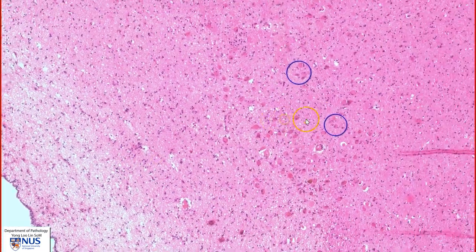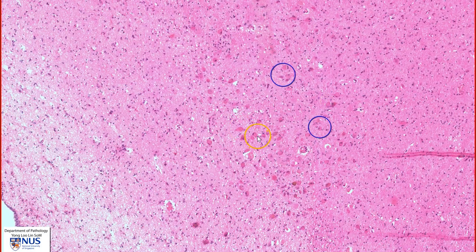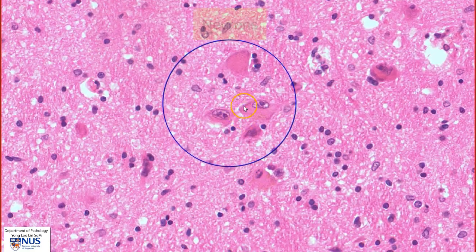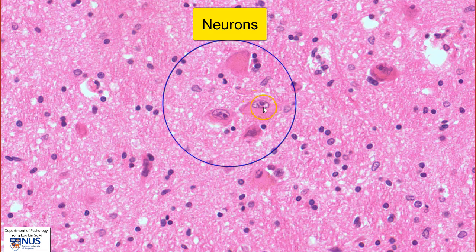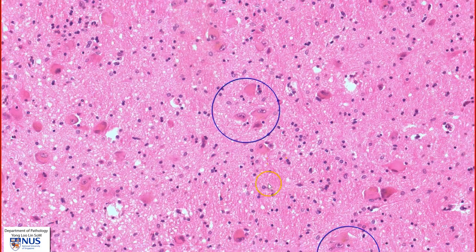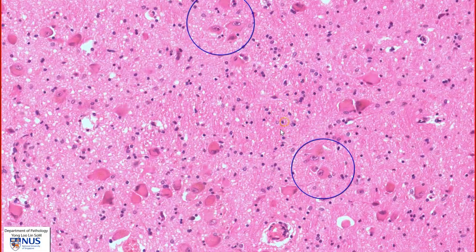Moving to this area, we begin to see some large neurons. This is the periventricular gray matter. We can see these roughly triangular-shaped neurons with large open or vesicular nuclei and prominent nucleoli. There is also some brown lipofuscin pigment within the cytoplasm, and there are many astrocytes in the surrounding parenchyma.